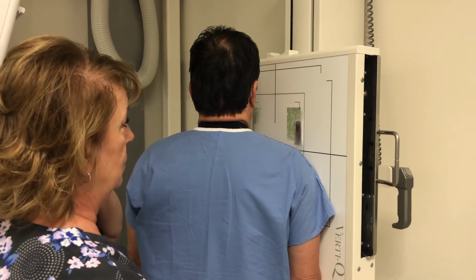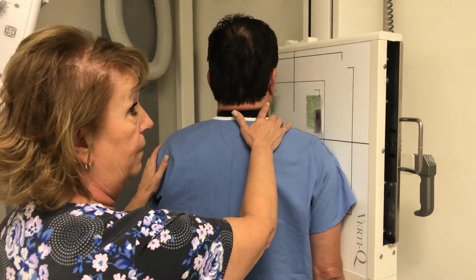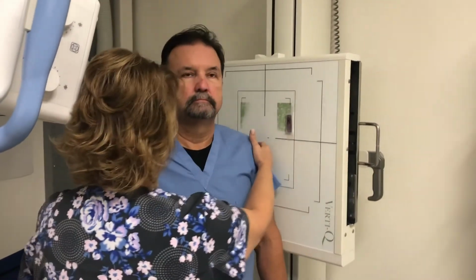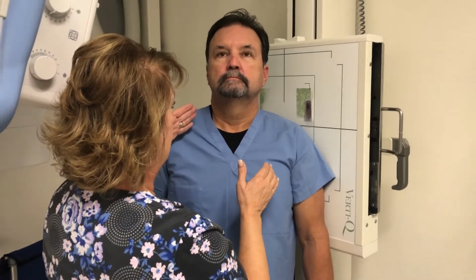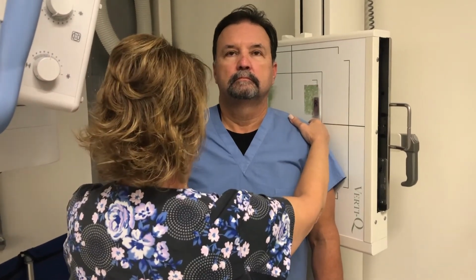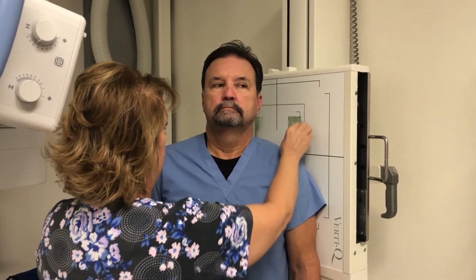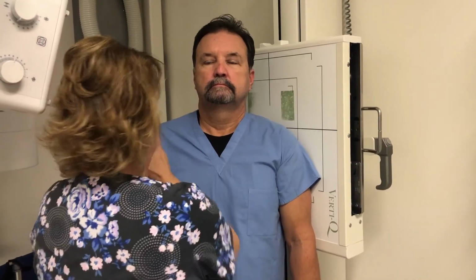Now I'm going to do the AP oblique that shows the right foramina as well. So if you can turn around, face the camera. So if I'm showing the right foramina again, now I'm viewing the side up. So I would have him at 45 degrees and I'll be viewing his right foramina, but I have to move my marker because now this is his right side.